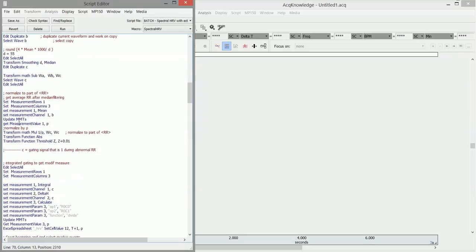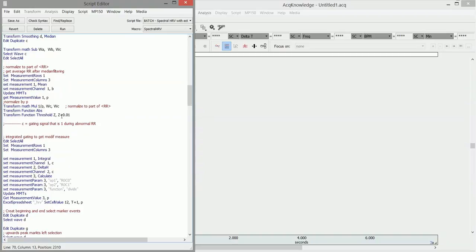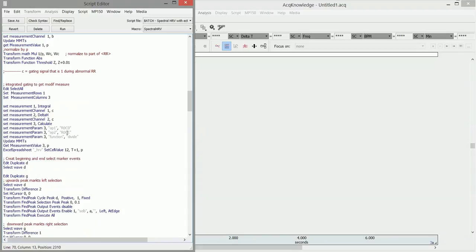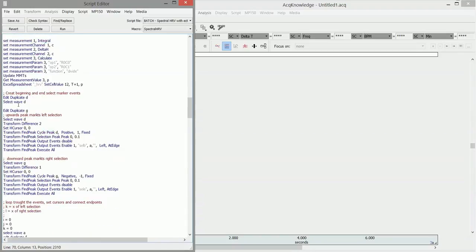And then I do have some tricks. To make this easy, I normalize the RR file, so I get the standardized detection threshold in terms of a percentage instead of something related to absolute heart rates. Okay, so this is just how the code looks.